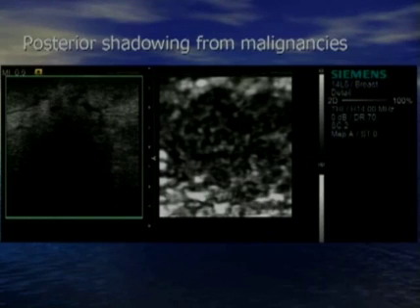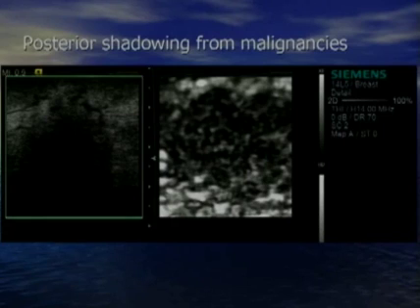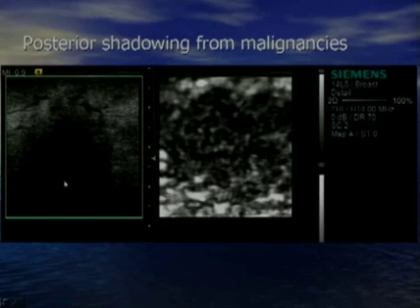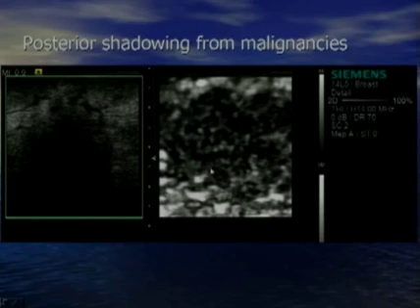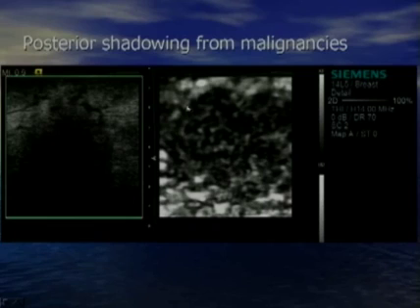In larger, harder cancers, we get significant shadowing on B-mode making it difficult to determine exactly where the posterior border of the malignancy is. The shadowing artifact does not occur on the elastogram, so you can clearly define the posterior margin of the tumor.